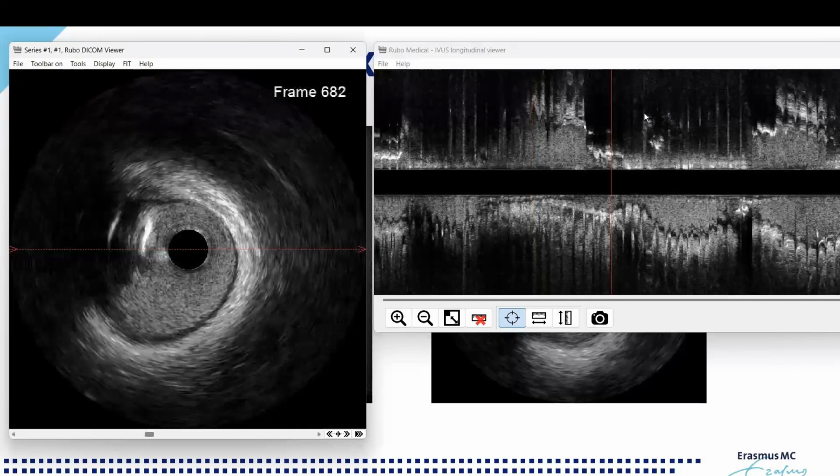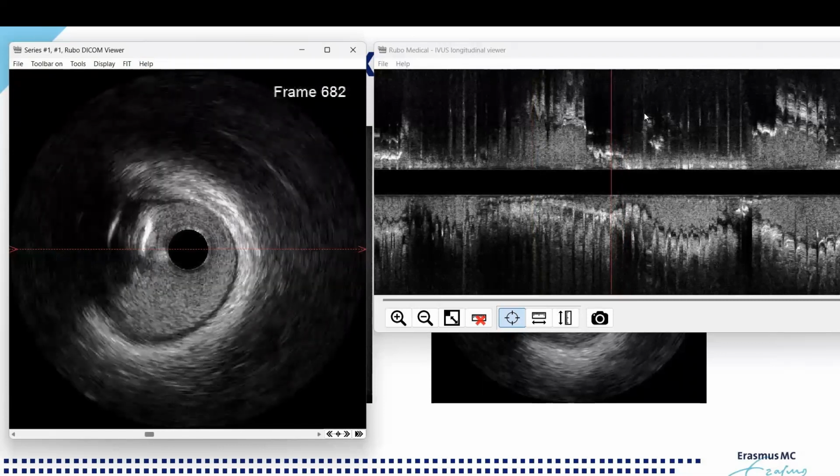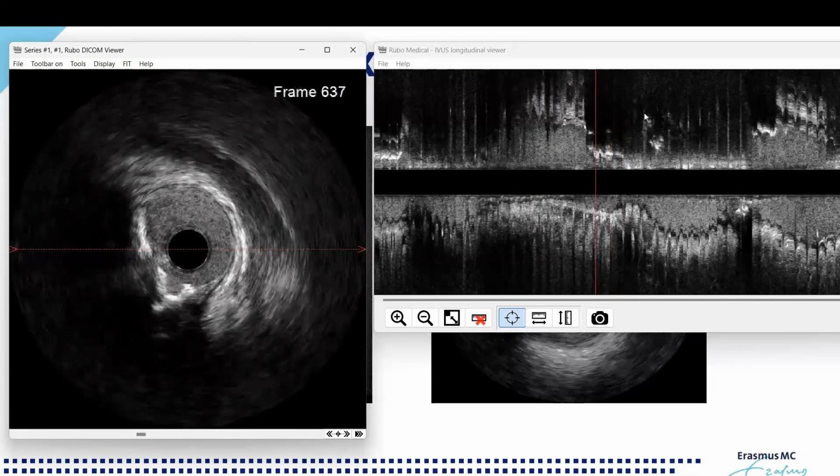So there is one thing, and we discussed it in one of the former sessions, and you can find that back if you look at the videos. But if you have plaque, I always see three types of plaque. First of all, if you want to determine plaques, you first look for the total vessel. Where is my vessel? The vessel is here. The outside of the vessel has a certain brightness. If you have plaque that is just as bright as or brighter than your reference density, the surroundings in here, then it's calcium.